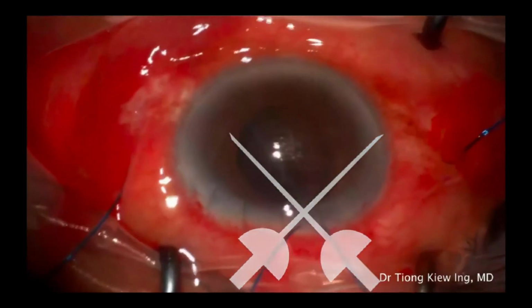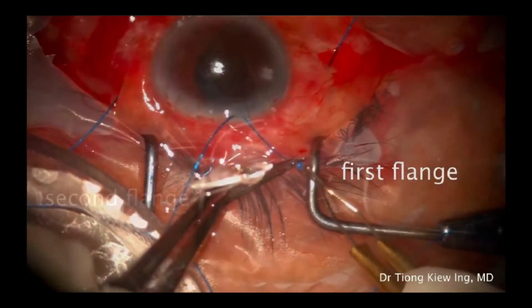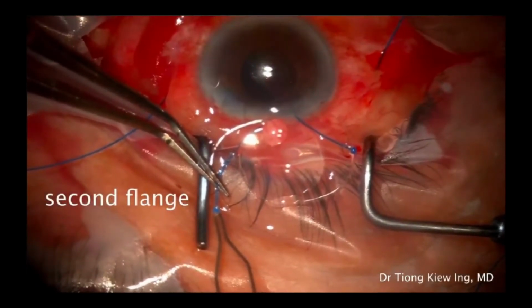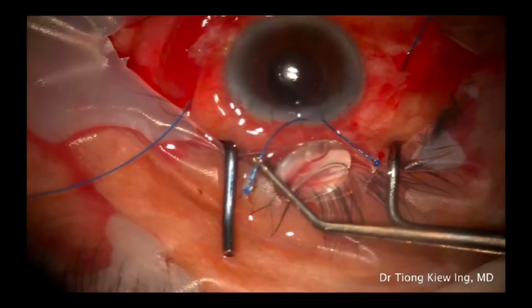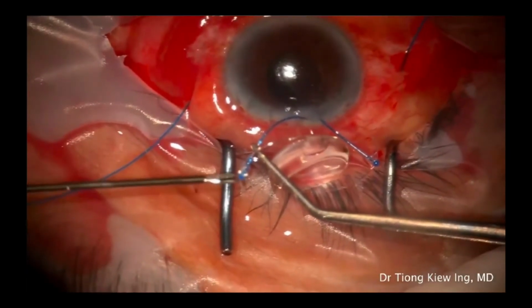Suture is then passed through haptic eyelet and first flange is created using portable cautery. Insert the other suture's end into the other eyelet and make a second flange. Both flanges are tested individually for their steadiness and stability. It is an important step to ensure the flanges do not slip through the eyelet of the lens.